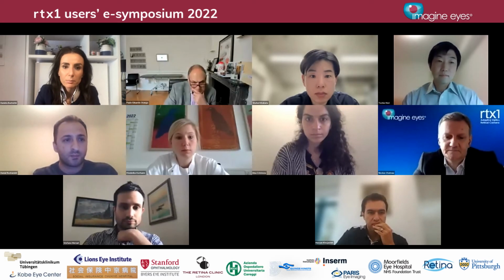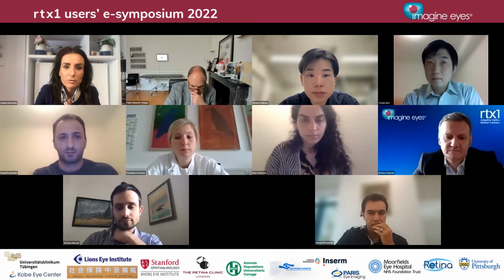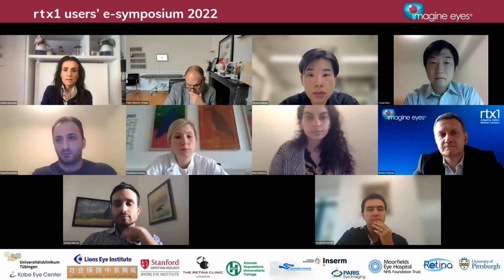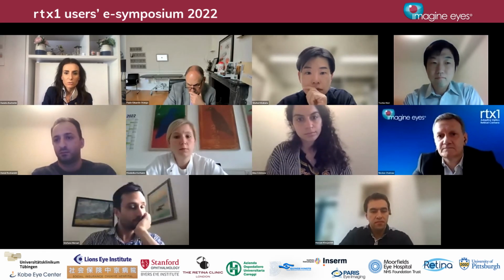We have a question from Pukrai Rishi, asking if we know of the adaptive optics findings along the hyperautofluorescence ring in retinitis pigmentosa.